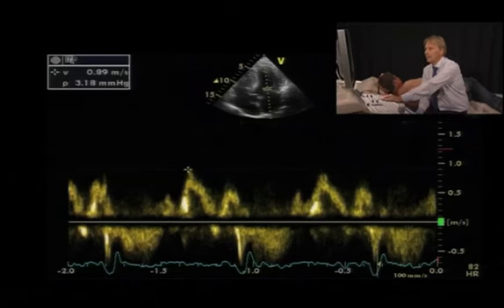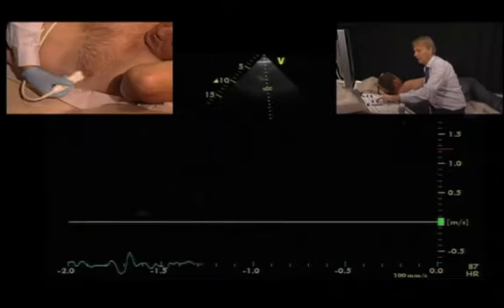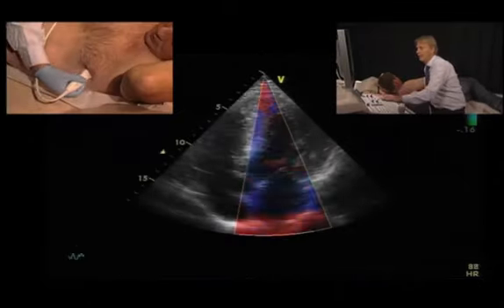So we'll now show you how to analyze a patient for diastolic function. This is a patient who has an E to A ratio which is above 1. So the E wave is taller than the A wave. So the question is, does the patient have normal filling or does he have pseudonormal filling? Let's measure the size or the maximum velocity of the A wave, which is somewhere in the range of 0.8. Okay, and now let's perform a tissue Doppler across the mitral valve annulus.